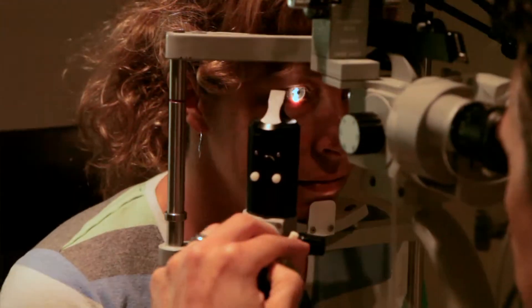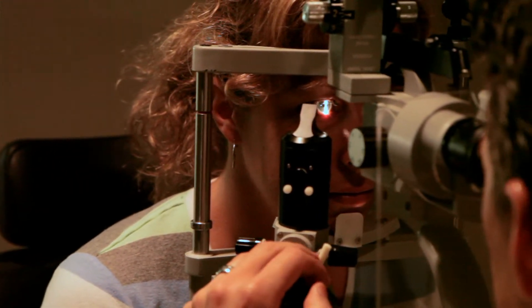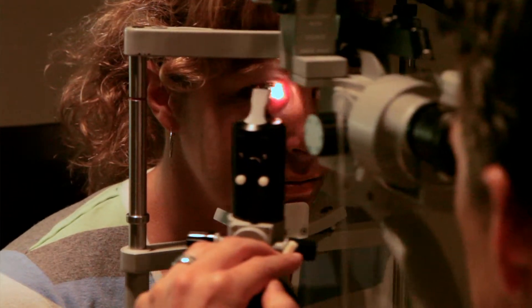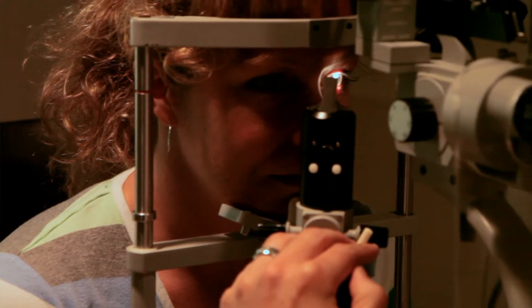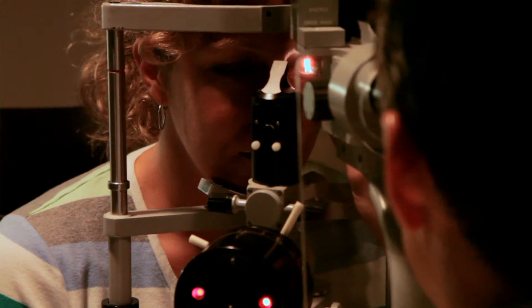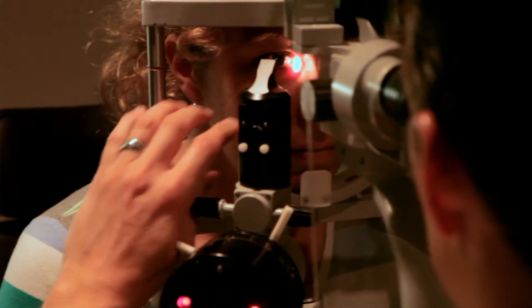Then they'll take a microscope called a slit lamp microscope — you'll put your chin on a little rest and there's a rectangular beam of light that comes in from the side. With that, the doctor can see a three-dimensional, magnified view of the eye. They'll look at the conjunctiva, which is the skin surface of the eye; the cornea, which is the clear dome that light goes through; the iris, which is the colored part; and the pupil, which is where light enters.